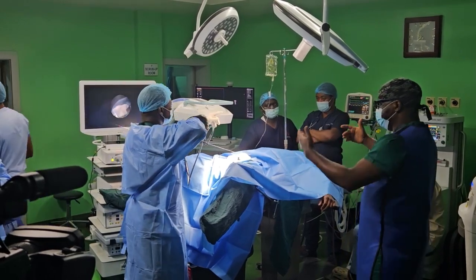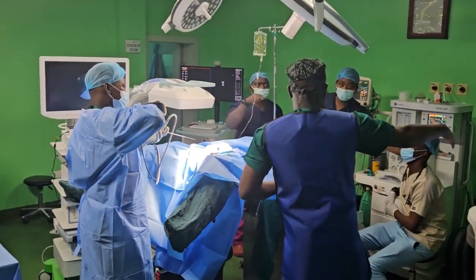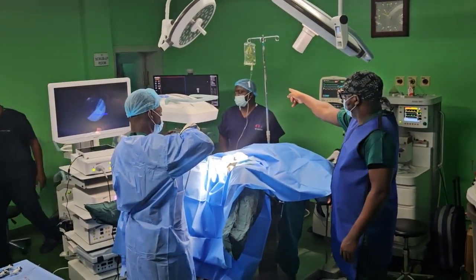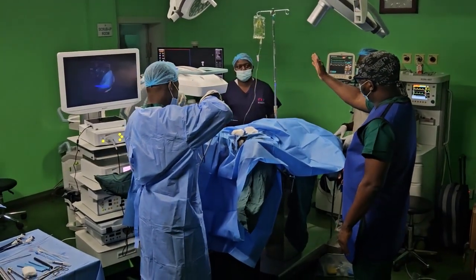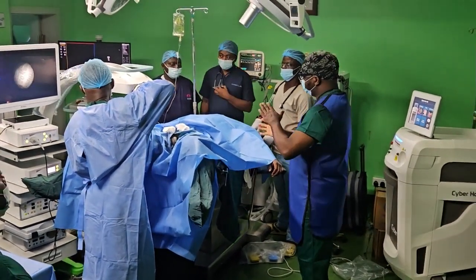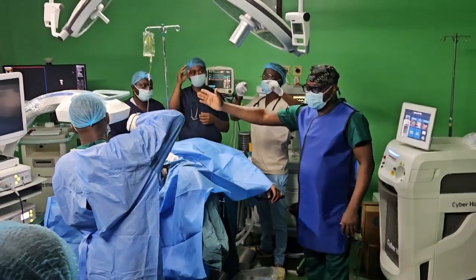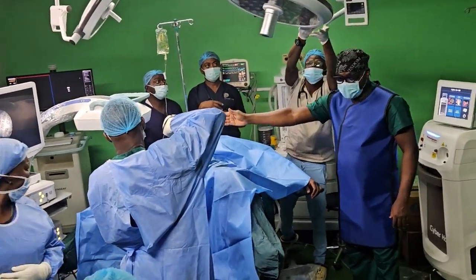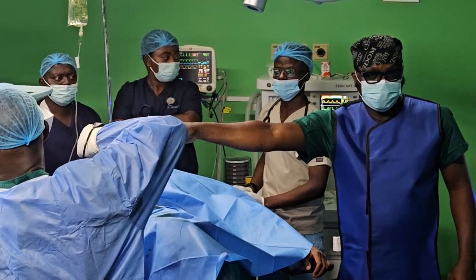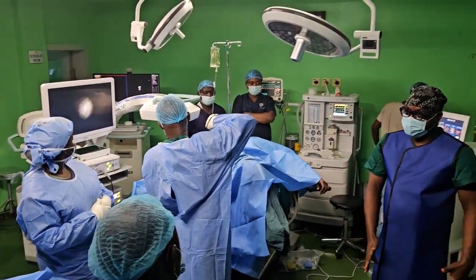So the setup is, when we position the patient prone, I will be on this side, working from this side. The laser is to my right. The screen is that way. I'm looking straight at the screen because I must see the fluoroscopy screen while I'm doing the puncture and dilatation. Sometimes when I need to get my orientation within the PCS, we go back to the screen. The C-arm generator is directly in front of me. The endoscopic tower is also this way. The nurses are likely to move their instruments this way when we start.